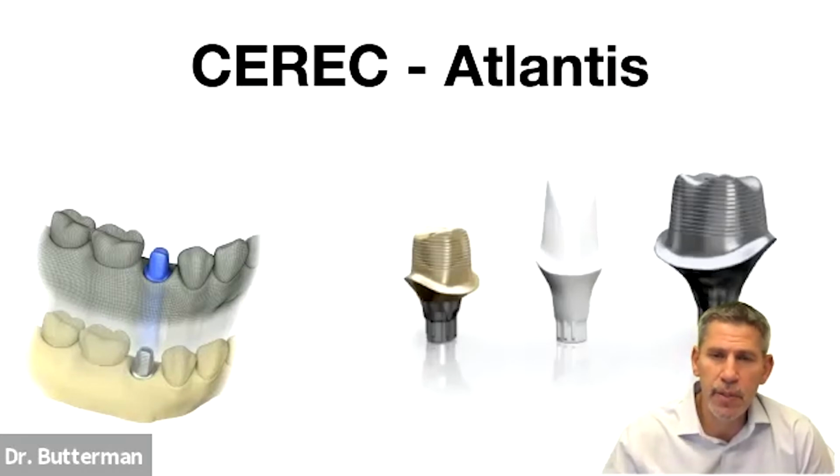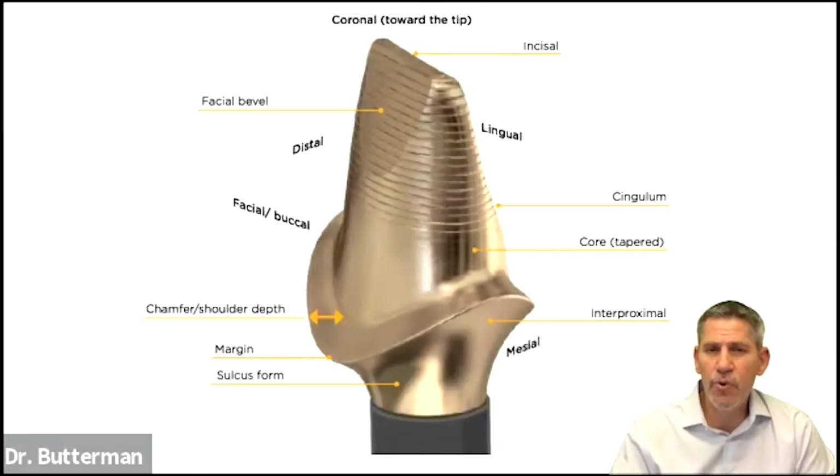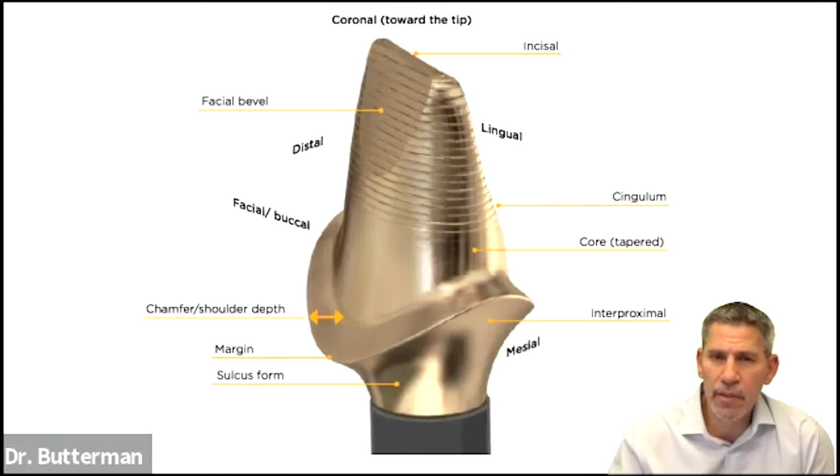Quite simply because it's easier and it costs about the same, but it's just much easier. So if you've never ordered an Atlantis abutment, they're pretty insanely good. The contours are fantastic, and the anatomy is there.